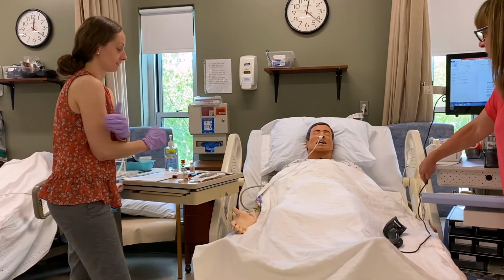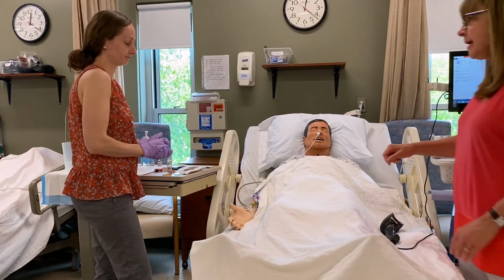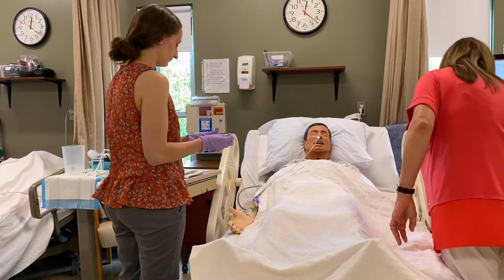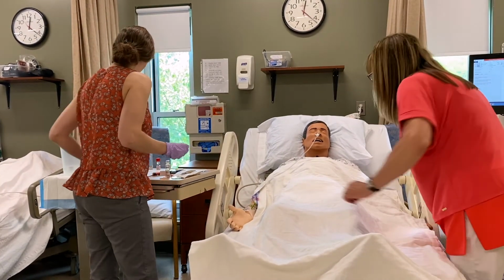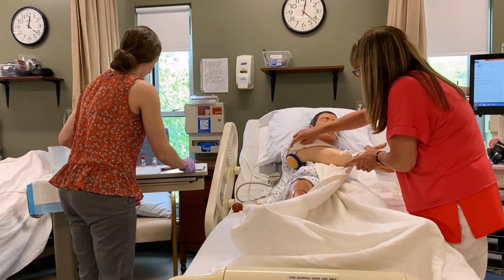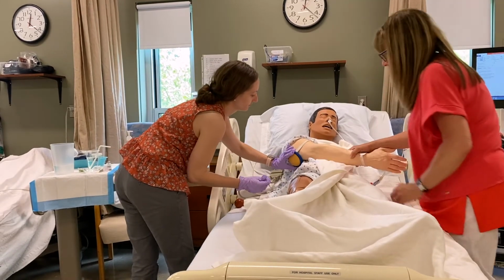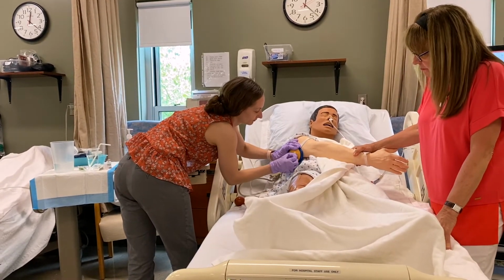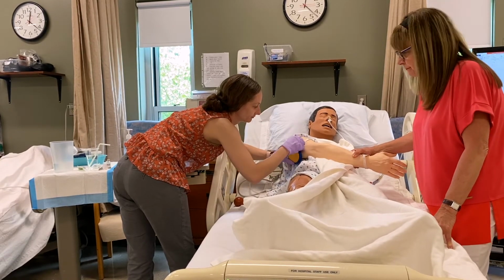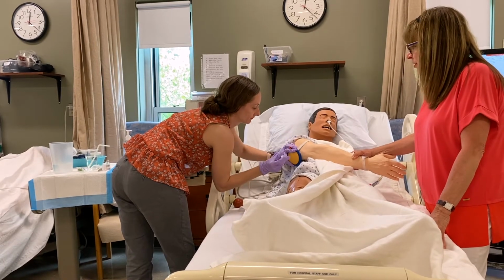Okay. So he normally gives insulin in his abdomen at home, and he'd like to have it behind the arm. Okay. The arm over for you. She's cleansing from the center out, and is going to keep the alcohol swab with her. Are you going to pinch or spread, nurse?